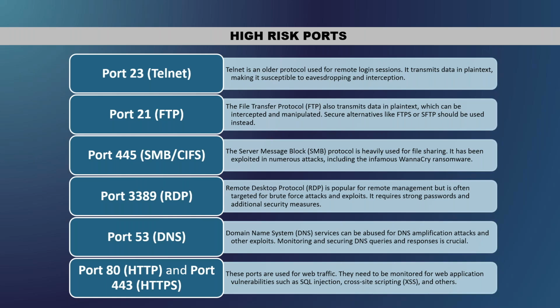When you start noticing that, and as I said, with the external connection, if the vendors are accessing that, you're like, okay, well, you have access to that. How wide a range are you going to be remoting into? What systems in your hospital are you remoting into? Ports 80 and 443 are your web server access. Obviously, HTTPS is more secure than HTTP, but now we're trying to move into 8080. So we ask them, can they move to 8080? Do they need 443? What do they need it for? And how do we limit access through those ports to only what needs it?